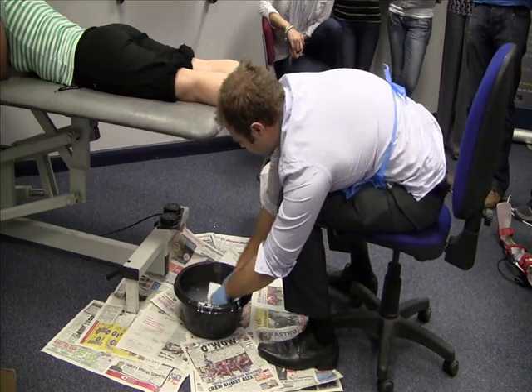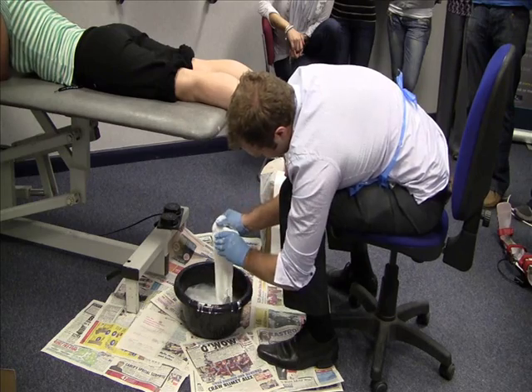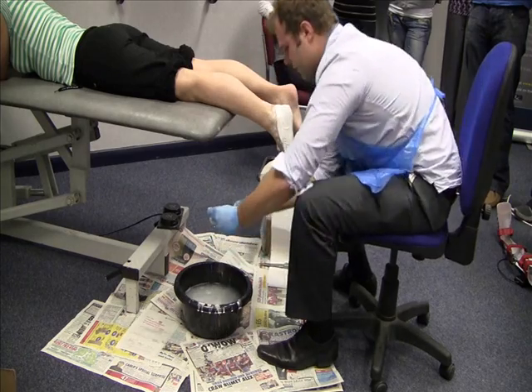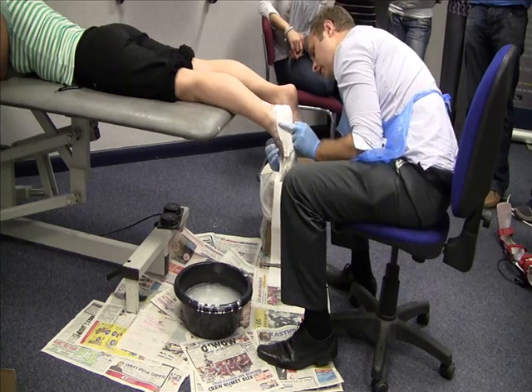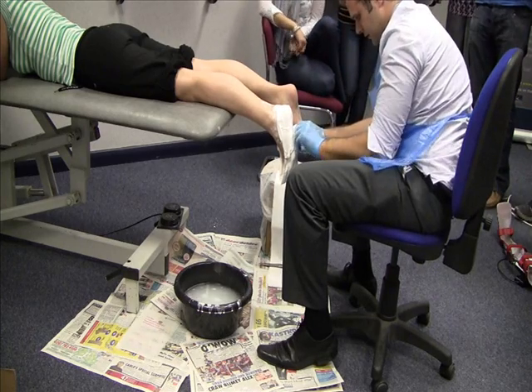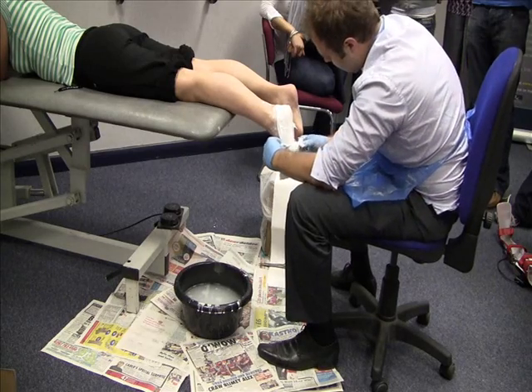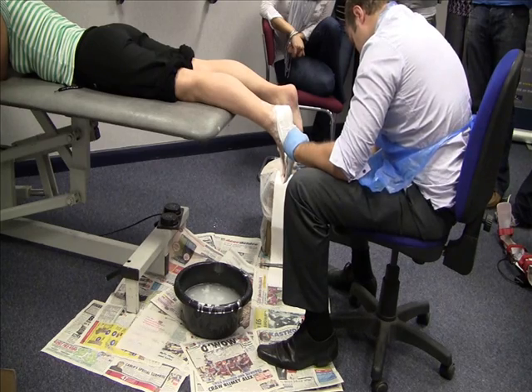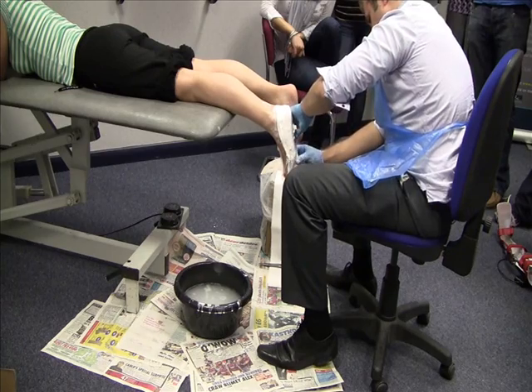Then with the second piece, submerge again. Smooth down. Fold over and loosely drape around the base of the foot. At the connection point, just make sure you get a nice connection. Again, going with the medial side and then lateral. If you have any excess material, try and get it around underneath the toes. Try not to affect that forefoot balance.